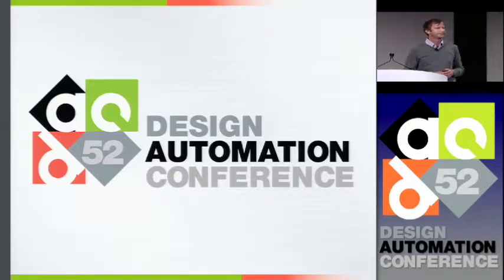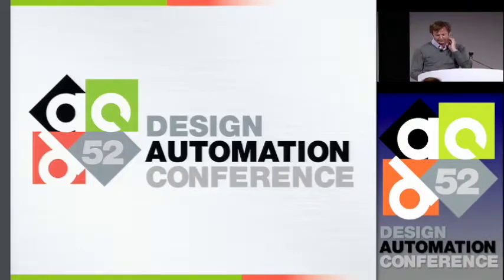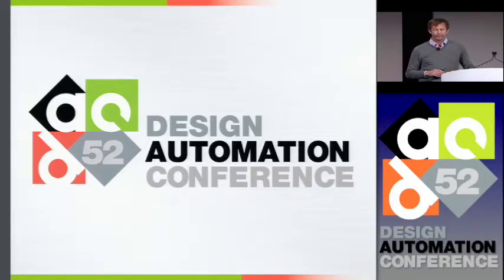Hi. Can you discuss the battery technology a little bit? Yeah, a little bit. We can't talk too much about the different suppliers we're using, but the same constraints were placed on the battery that were placed on the other parts of the system, which is, okay, well, we want to have energy storage, but the rule is anything we put into this contact lens has to be as small as the SoC. That has to be the limiting factor. And that was the case with all the energy storage devices we used as well. The other constraint, and this was a constraint for the chip designers especially, is okay, well, this is the number of electrons you have to work with, and you need to make sure that you can log data throughout the entire day.